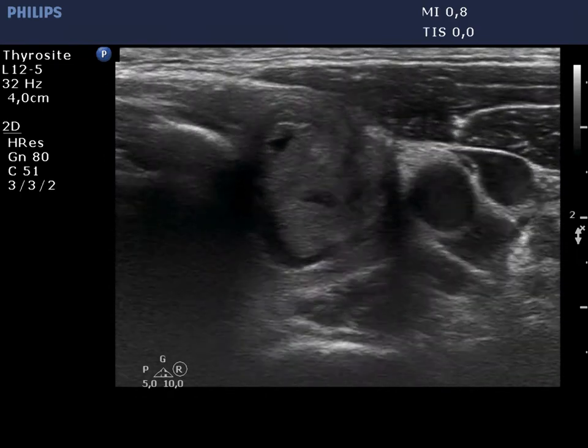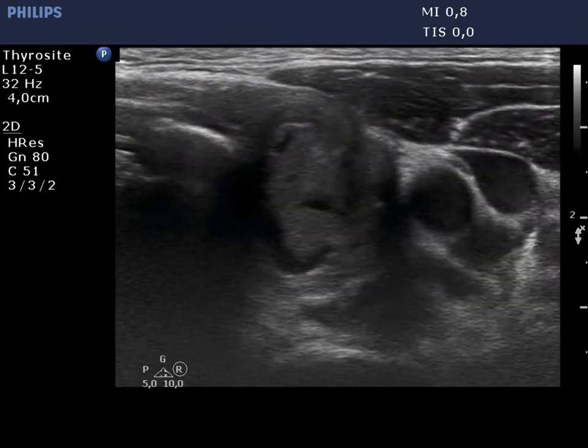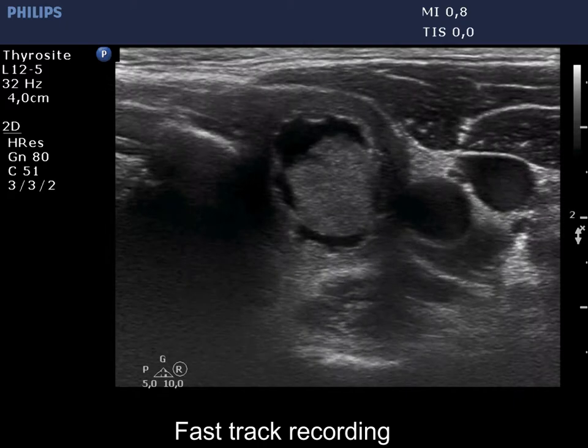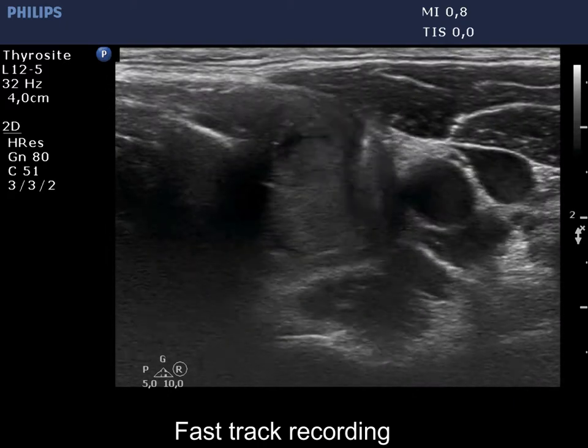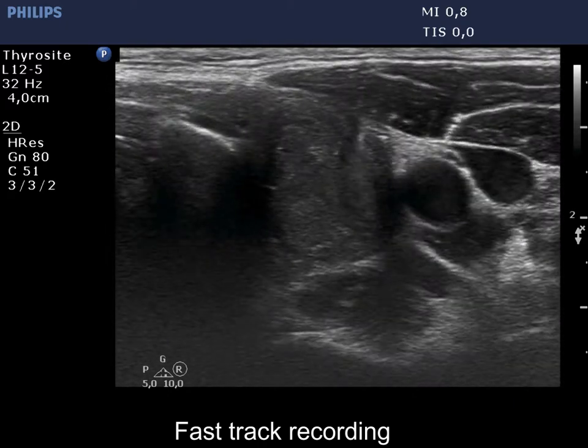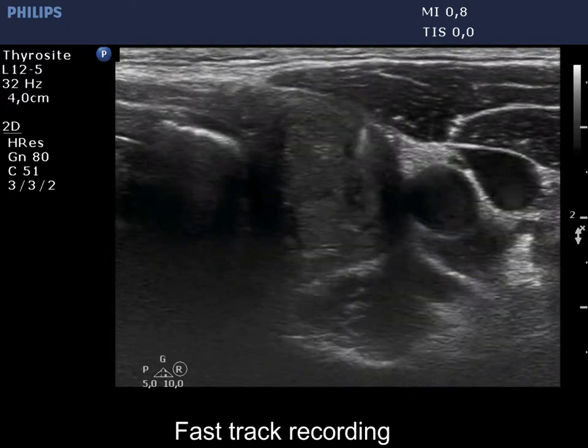Now, the first phase: the attempt to remove cystic content. At this time we did not succeed because we could aspirate no cystic fluid.